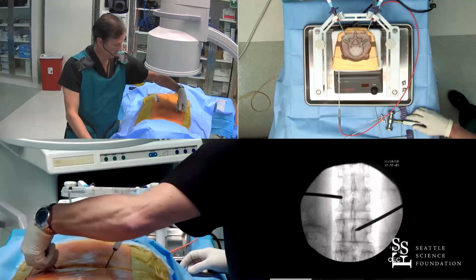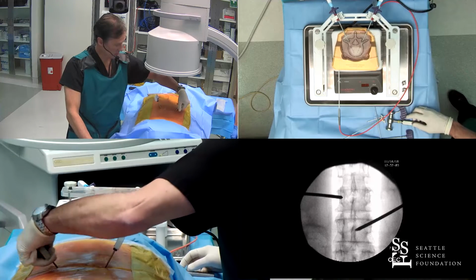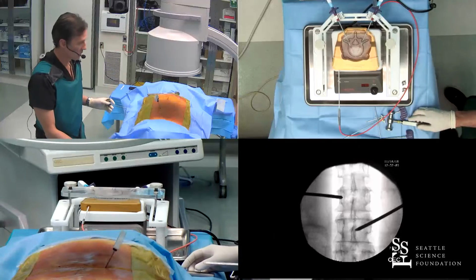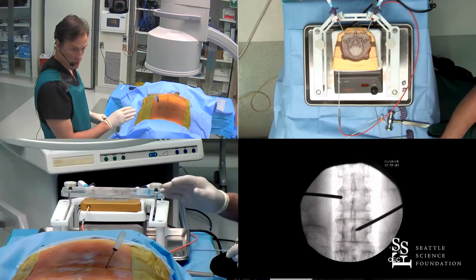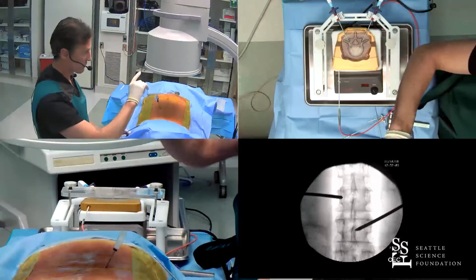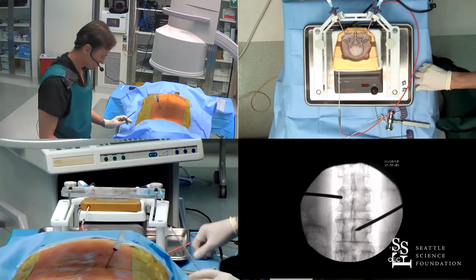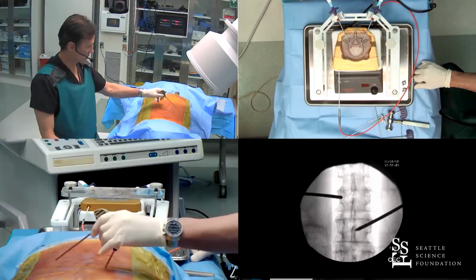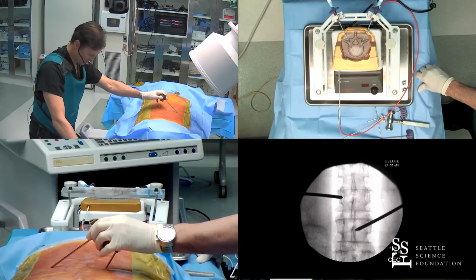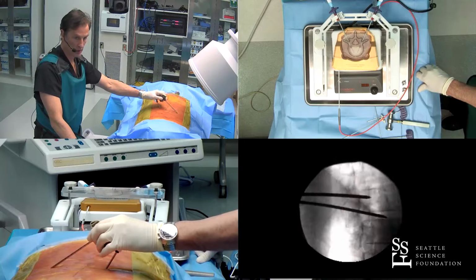So let me demonstrate one more. I'll use the same vertebral body. That's nicely lined up. So we're going to go 45 degrees toward you. So this is called the inferior end-plate approach, the modified inferior end-plate extrapedicular approach.